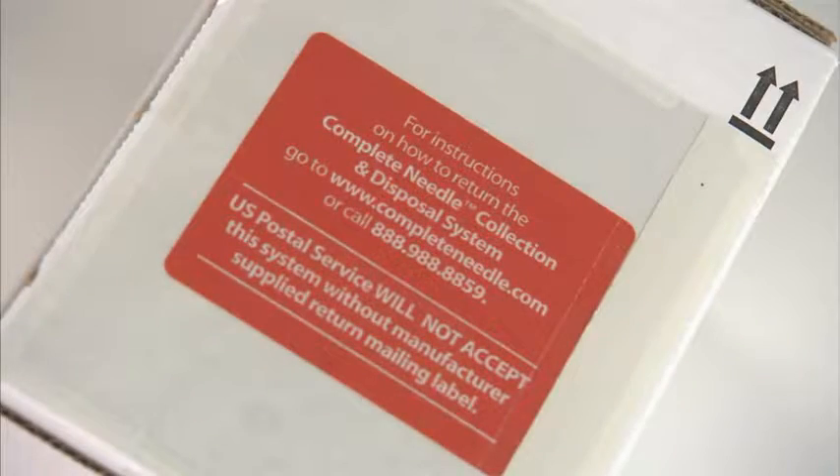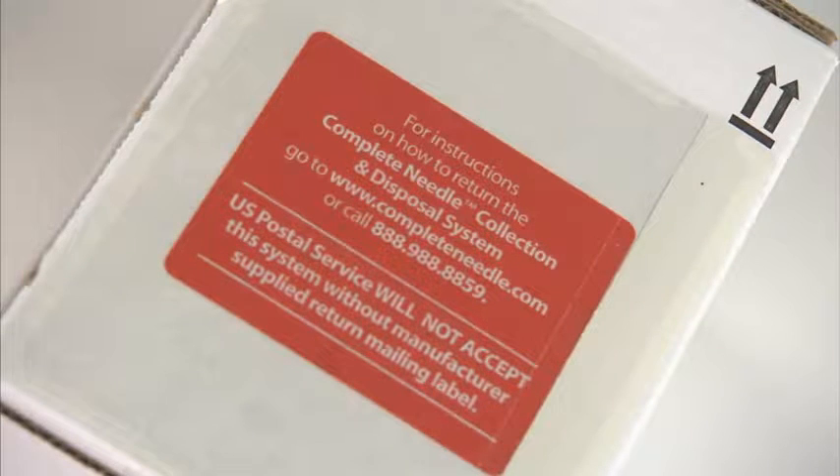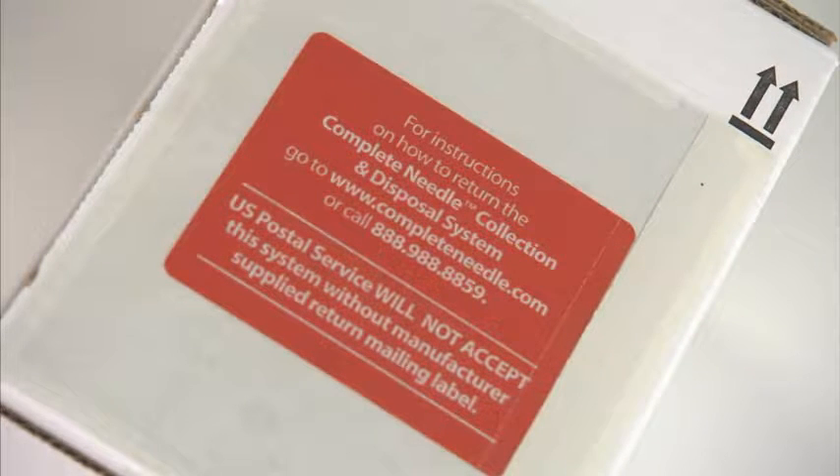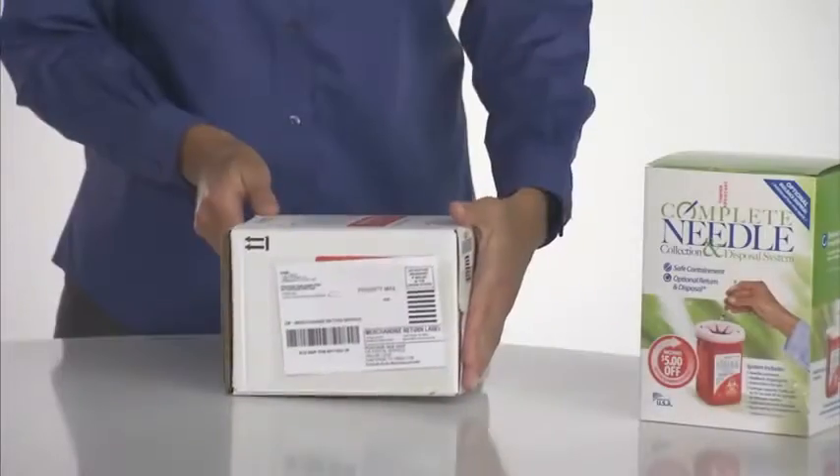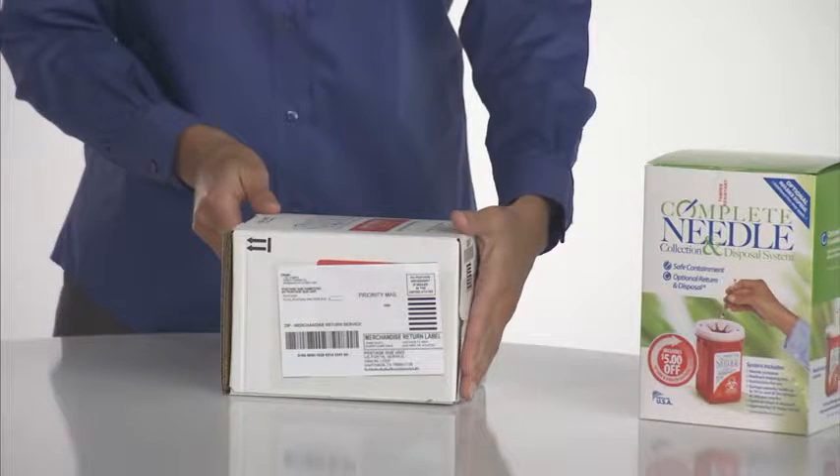Remember, the post office will not accept your box without this return mailing label, which can only be provided by the Complete Needle Program. You are now ready to give the box to your mail carrier or take it to the post office. No additional postage is required.